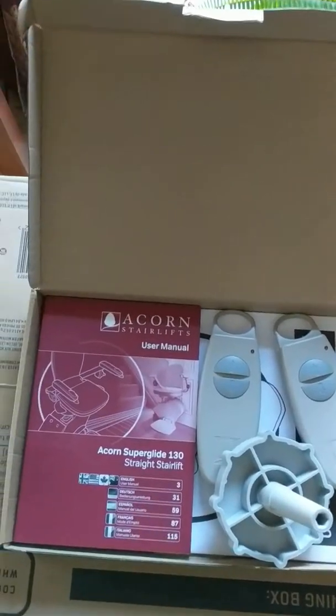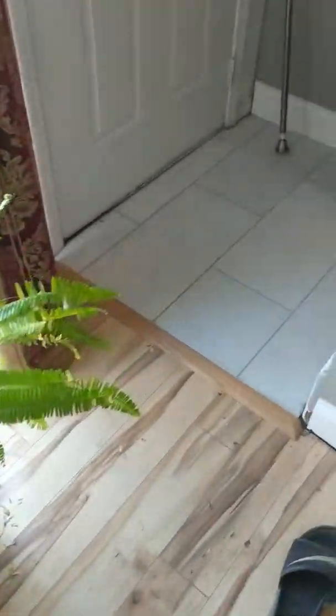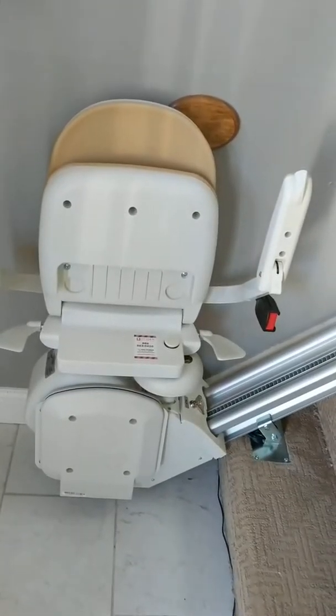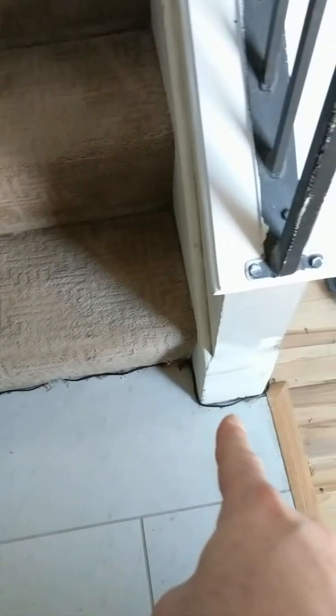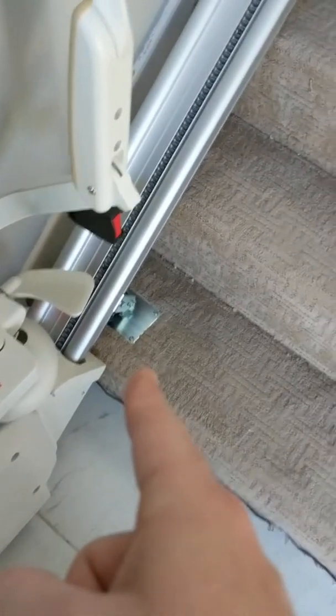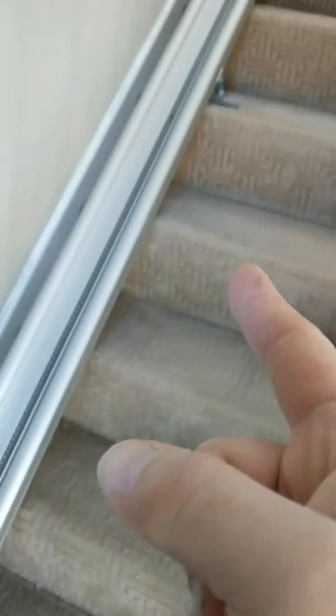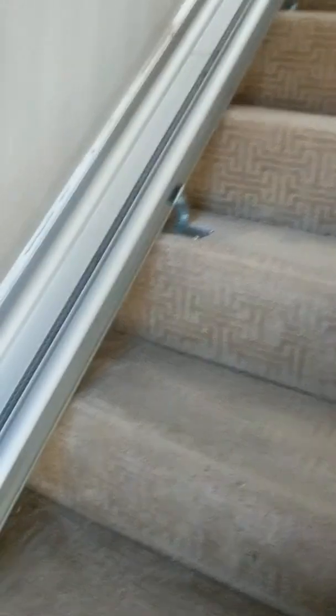It's a simple installation. If you need to move — like if you sell your house — you can remove it yourself. As you can see, they just ran a regular power cord to plug in, and the track is just pre-drilled holes with screws. There are four brackets screwed into the stair. The stair lift came with two remotes.